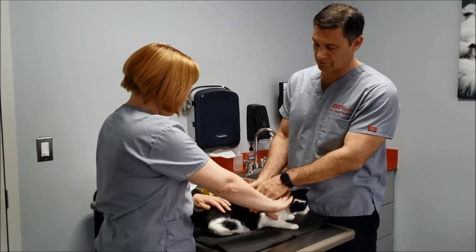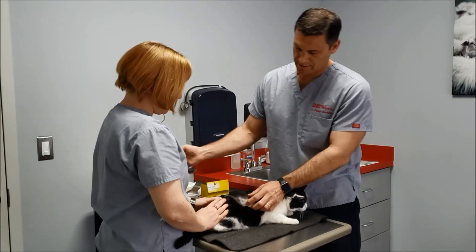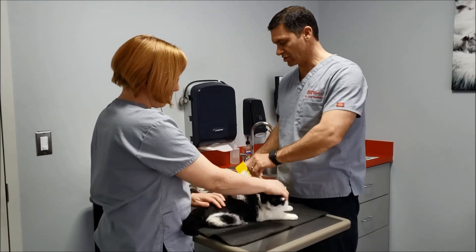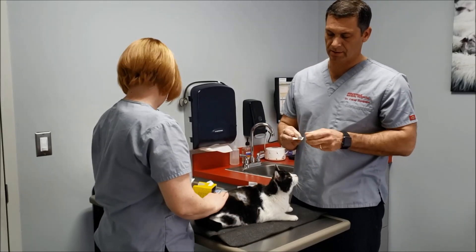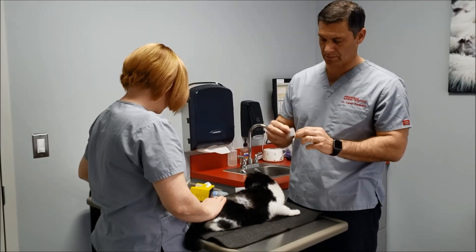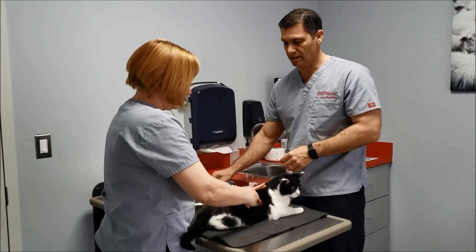She's already started to grow her hair back here, so I've got to shave a little bit of that, just to get it clean. Then do a gentle wipe with alcohol — it helps make sure that the Libre can stick. It comes automatically with its own alcohol pad, so just a quick wipe there.